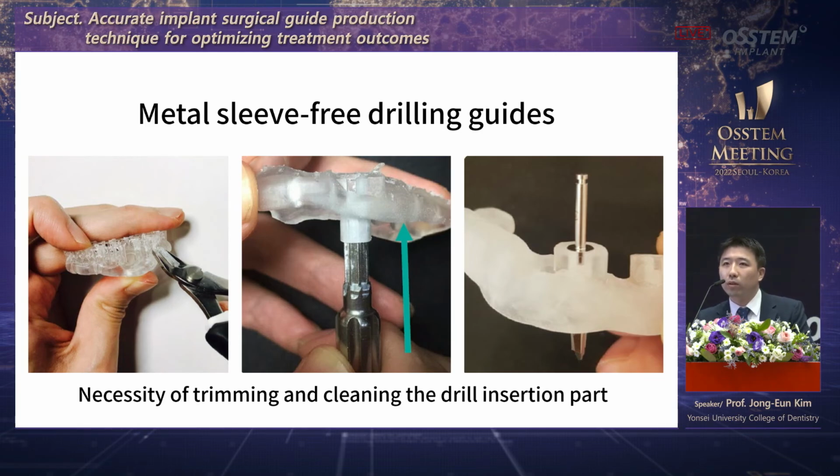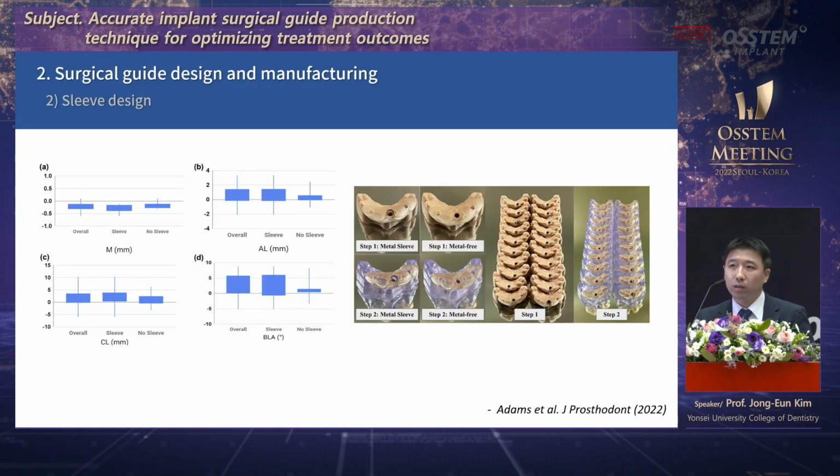As of late, the polymer printed guides are now available without sleeves. The biggest issue here is that on the inner surface of the sleeve, you need to do trimming, and you need to check whether the drill goes in passively, and this is essential for accurate surgery.